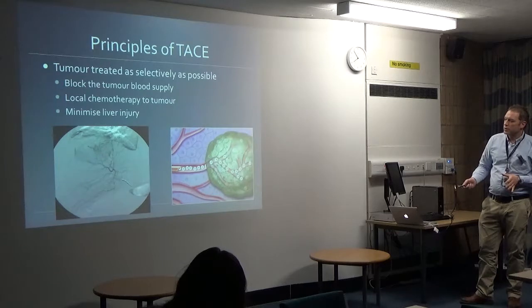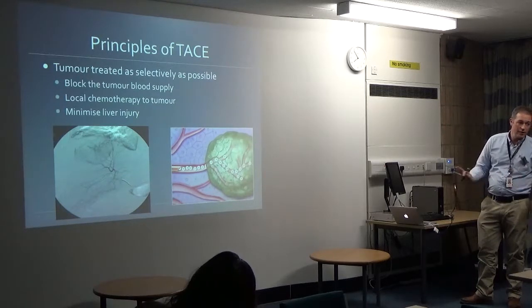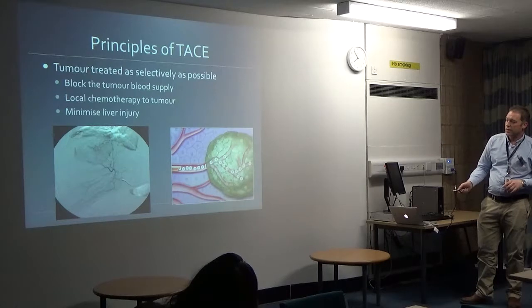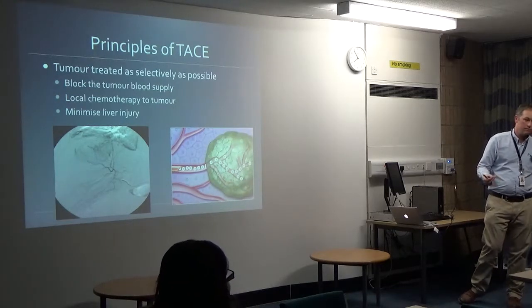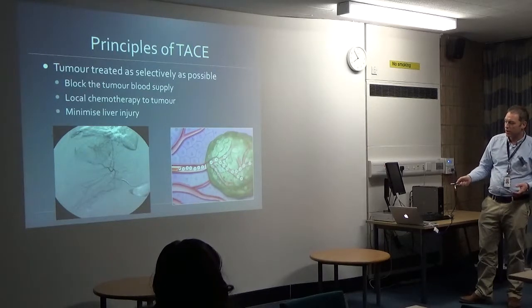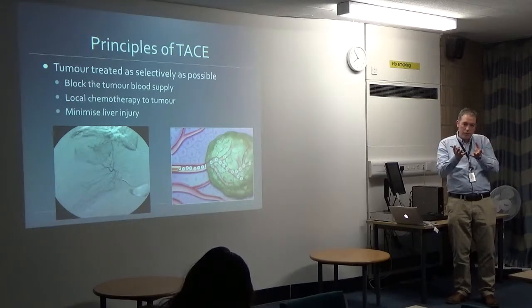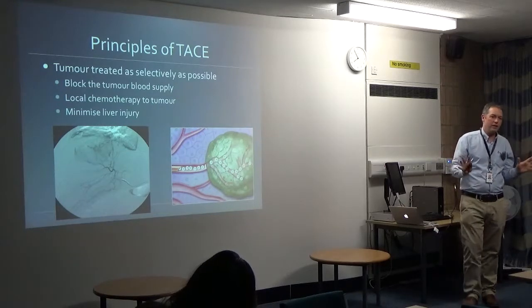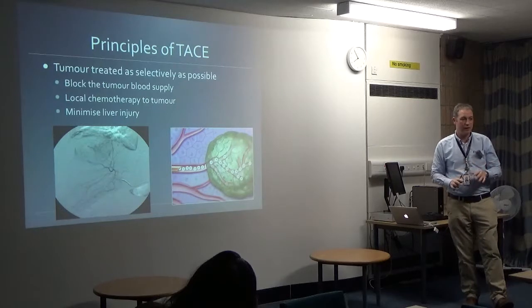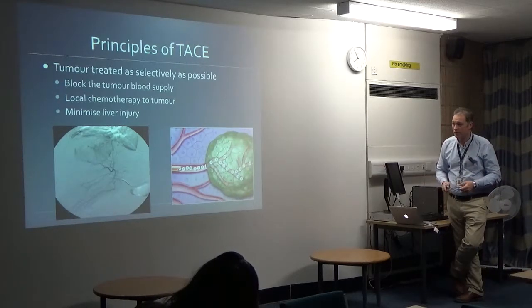So the idea is that we treat the tumours as selectively as possible. We get all the way out into these blood vessels that go to the tumour, and leave all the other innocent bystander liver alone, essentially. We inject these tiny beads that are 200 microns in diameter, so that's 0.2 of a millimetre, into the tumour, cut its blood supply, and then out of the blocked blood vessels within the tumour leaches chemotherapy. But it just leaches locally into the tumour, and very little of it goes into the bloodstream. So patients might think, I'm getting chemotherapy, I'm going to lose my hair, but you don't get any of that at all. We don't see it. The risks are very, very small.